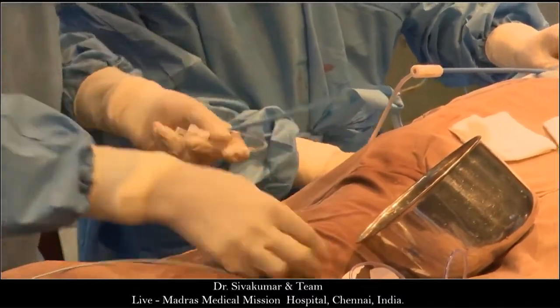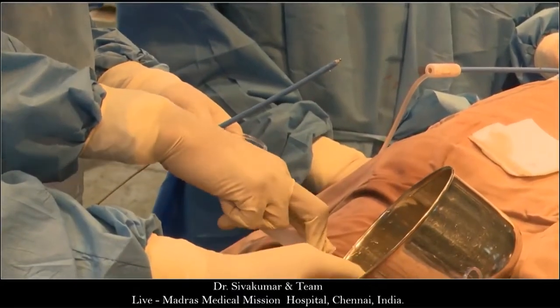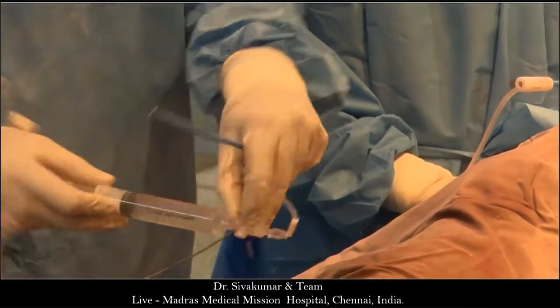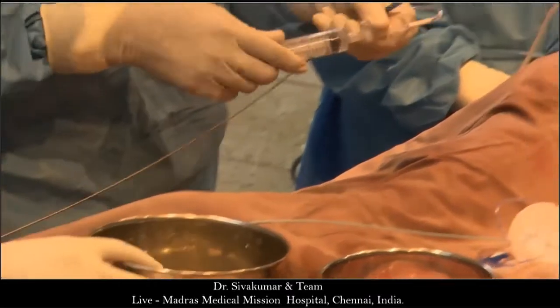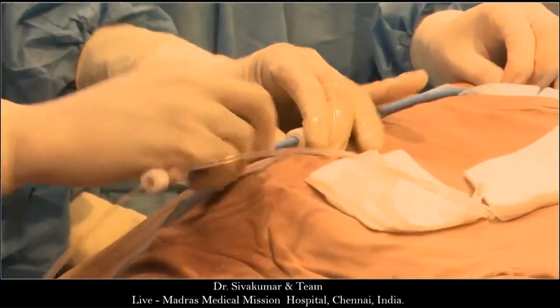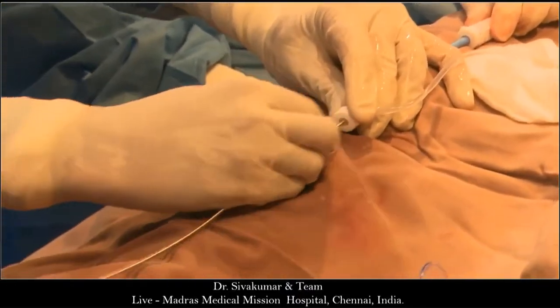Okay, so now interestingly, 10 years ago, 100 units per kilogram gave us an ACT of about 300. I don't know whether anyone else experiences this, but now 100 units per kilogram often doesn't give us up to above 250, and I have no idea why that is. But it seems to be universal in the UK at least. Maybe Brexit again. Brexit again. We're getting the cheap heparin in the UK. Yeah.